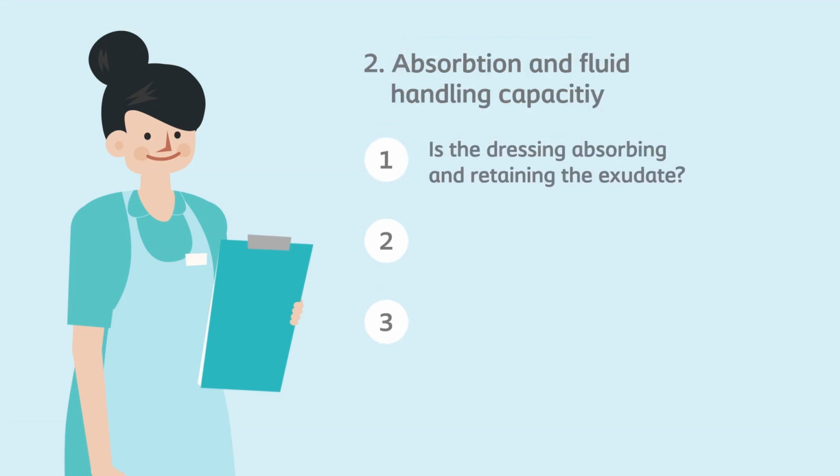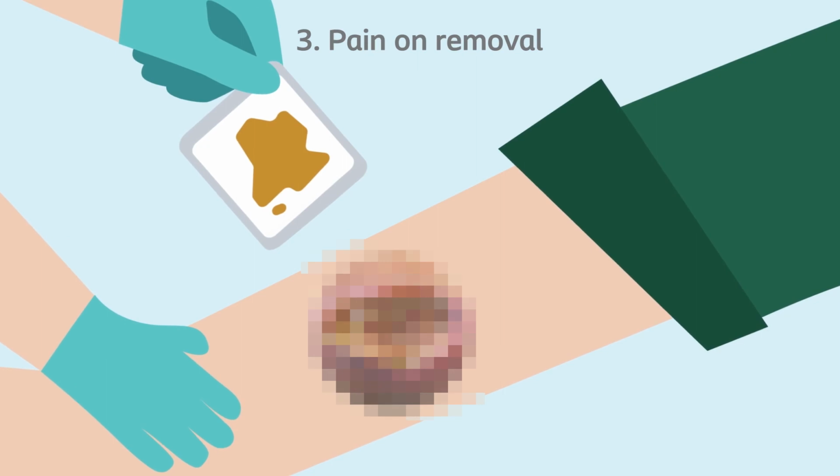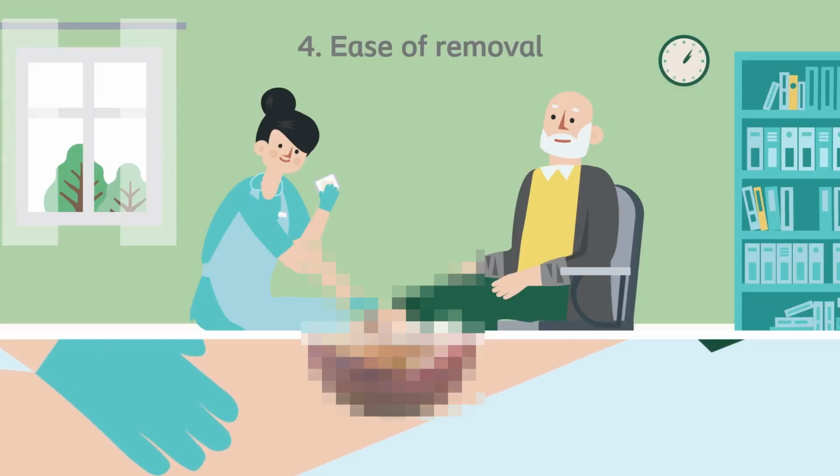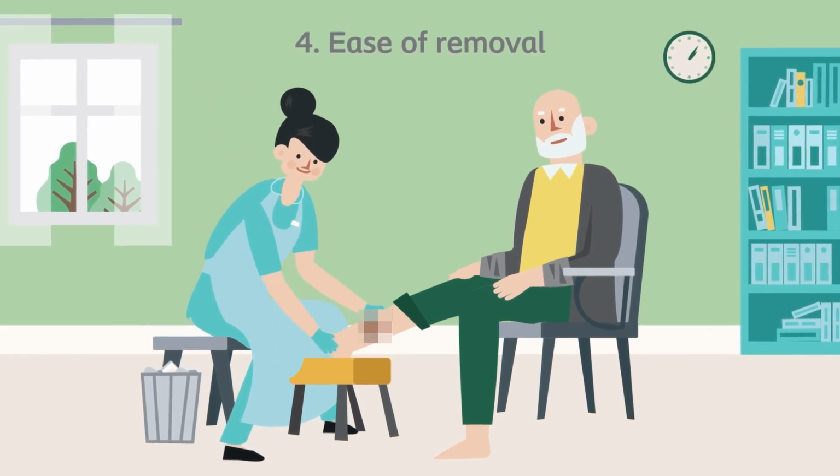Is the dressing absorbing and retaining the exudate? Is it managing the excess exudate? Can it manage exudate under compression? Does the patient experience pain during dressing removal? Is it easy to remove? What is the condition of the peri-wound skin upon removal?